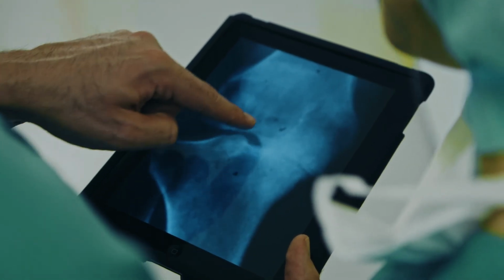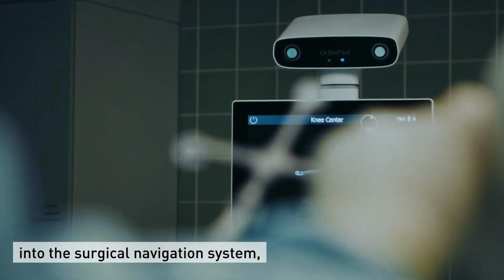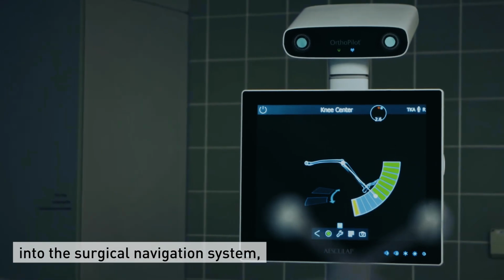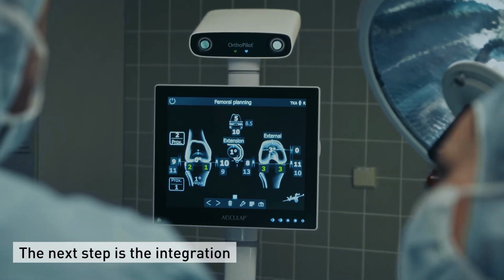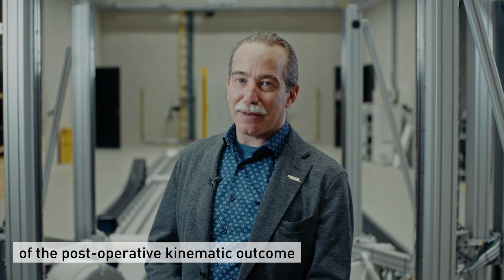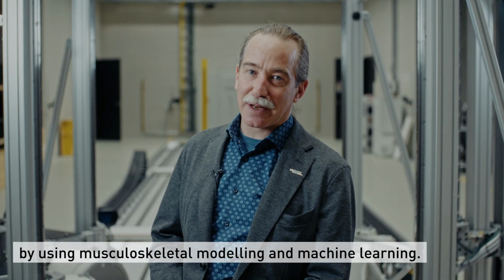after surgery. The first simulation model was already implemented into the surgical navigation system, allowing the surgeon to place implants in a safe corridor. Next step is the integration of the post-operative kinematic outcome by using musculoskeletal modeling and machine learning.